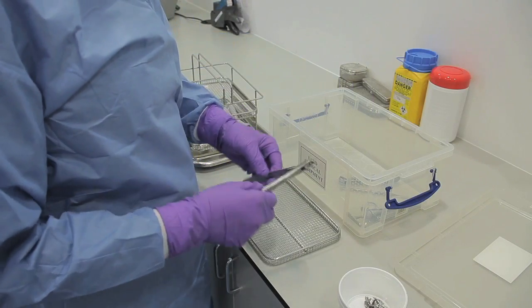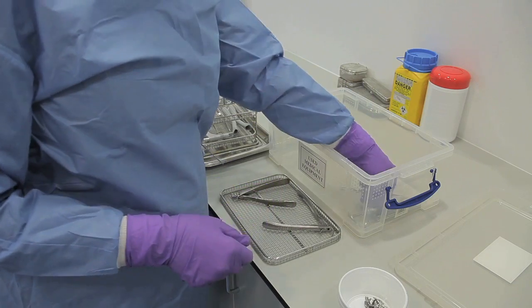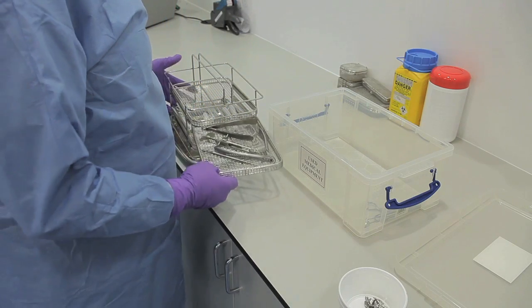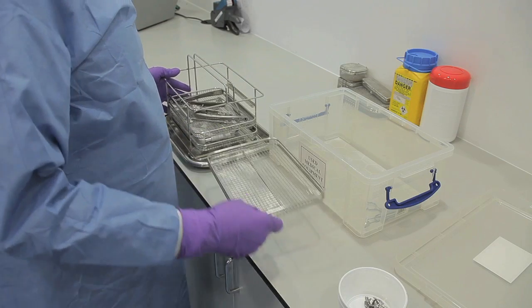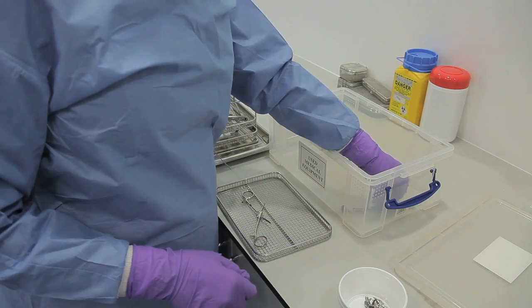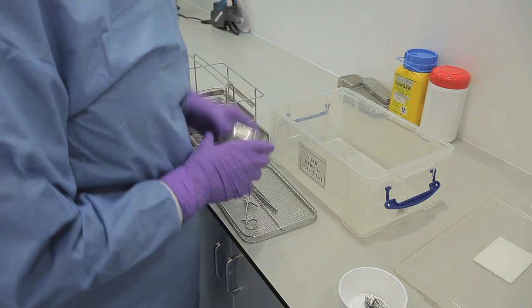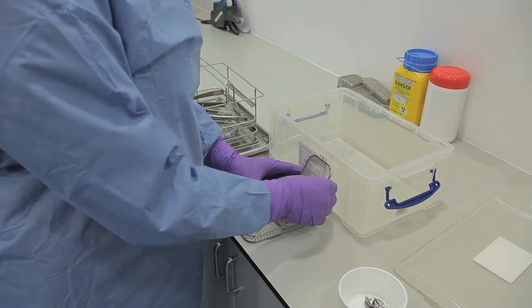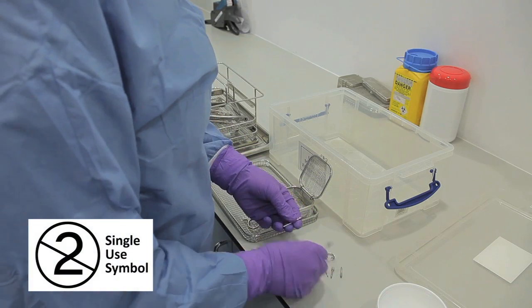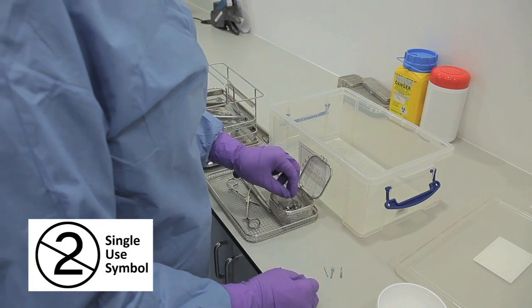Remember to open any RIMD with a hinge before placement in the ultrasonic bath. Opening the instrument ensures all areas will be cleaned thoroughly and that no parts are shielded or masked from the cleaning process. Do not overload the ultrasonic bath with RIMD. Overloading may result in the inadequate removal of organic material from the RIMD. Handle RIMD carefully to avoid percutaneous injury and use heavy-duty gloves. If any single-use burrs or items are brought into the LDU, these should be disposed of in a sharps container.